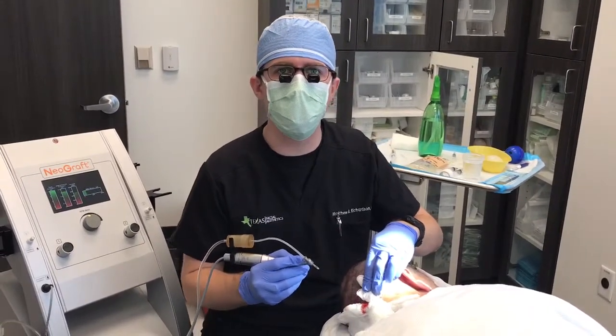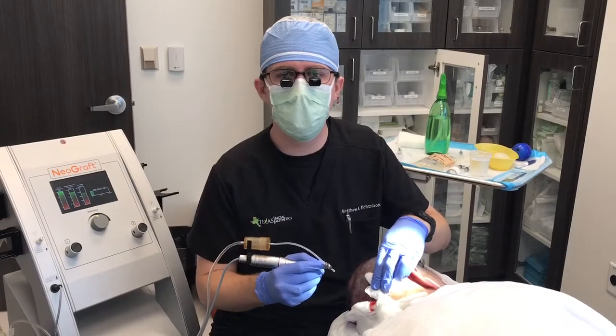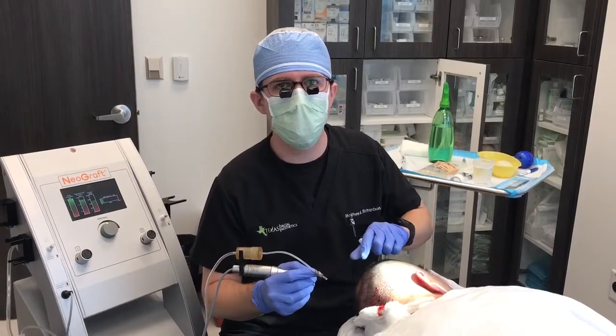We're performing a hair transplant procedure today. I'm going to demonstrate how we harvest the grafts from the back of the scalp. There are several different ways that we can take the hair from the back of the scalp and move it to different areas on the head.